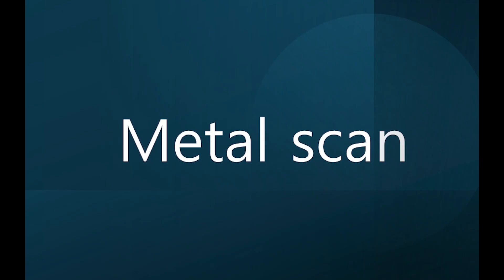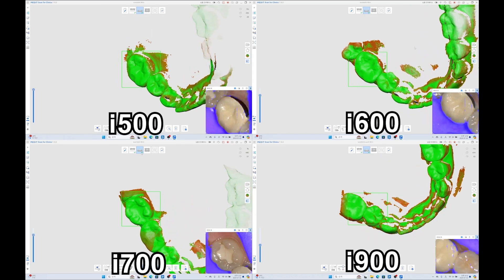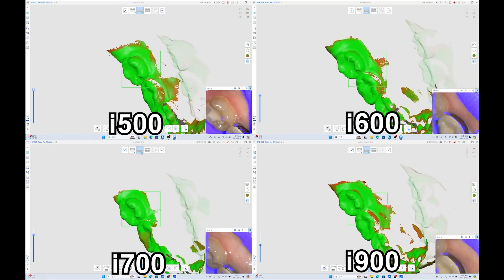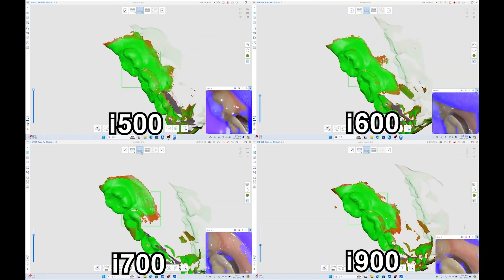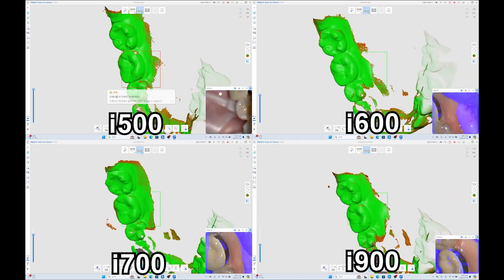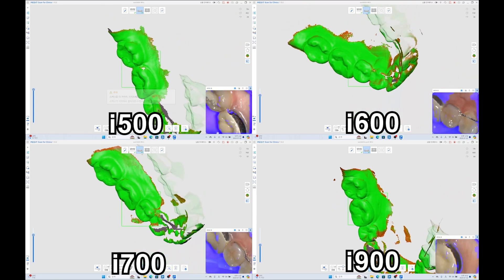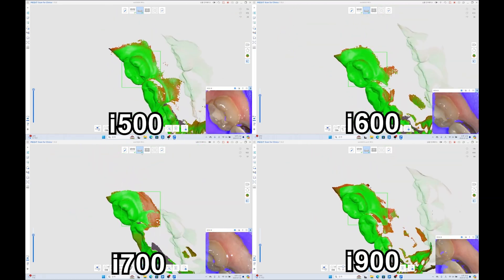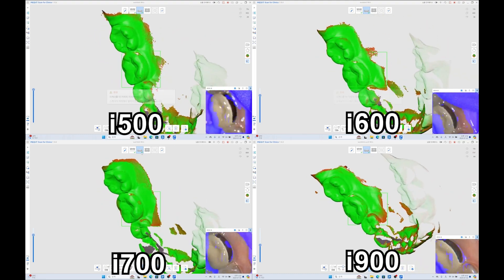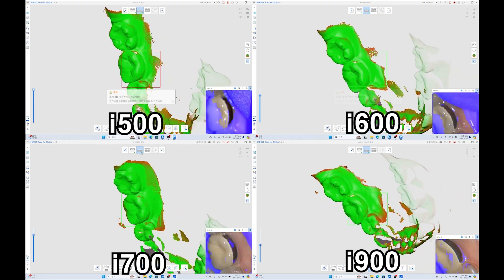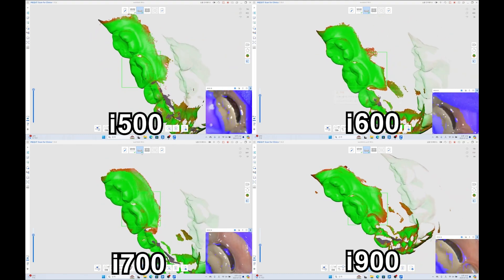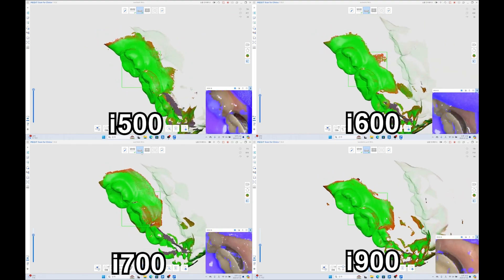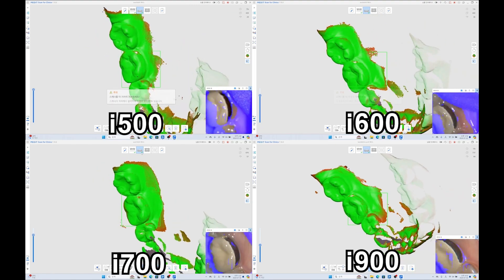Metal Scanning. For metal parts such as PFM, a separate video segment highlights how the new I-900 scanner recognizes metal parts without delay. The immediate recognition of metal parts by the I-900 is particularly impressive.